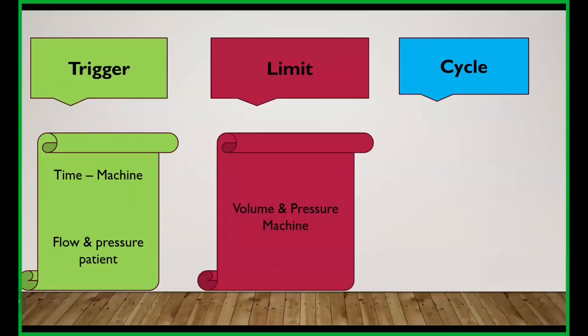Then limit. As you all know, in volume control and pressure control ventilation, you can keep the limit to reduce barotrauma or volume trauma. There are certain modes that have certain limits, and that can be achieved during your inspiration.